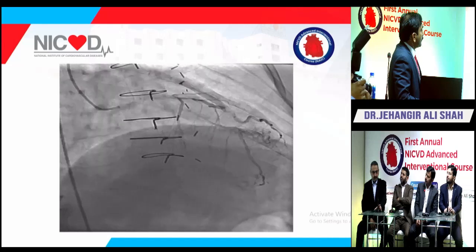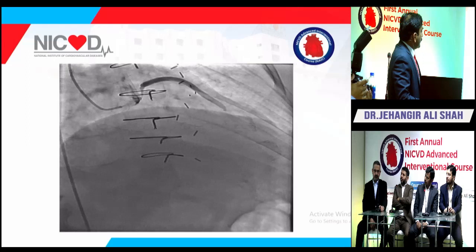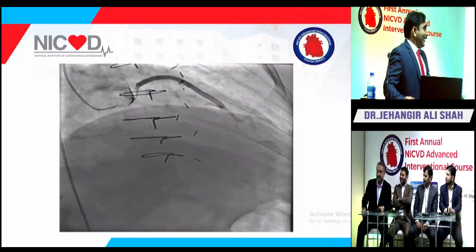There are also retrograde collaterals filling the LAD from this SVG. You can see the first septal coming here. There is also retrograde filling of the OM branch, and you can see the RCA is also filling from this.